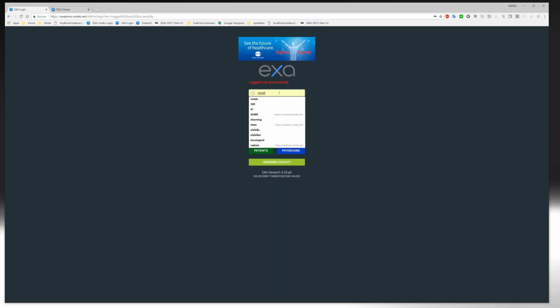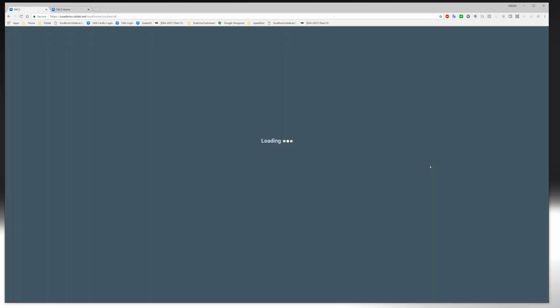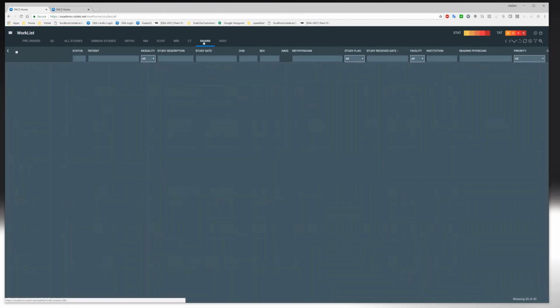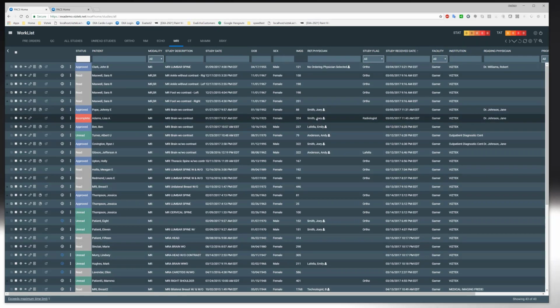We do require a stout server. The server has to meet our specifications because we're doing a lot on the server. But because we do server-side rendering, I'm not doing very much on my local workstation at all. In other words, when I bring up this list, when I bring up a study, I double-click on one of these enormous studies, I'm not really expecting my local box to do very much at all.